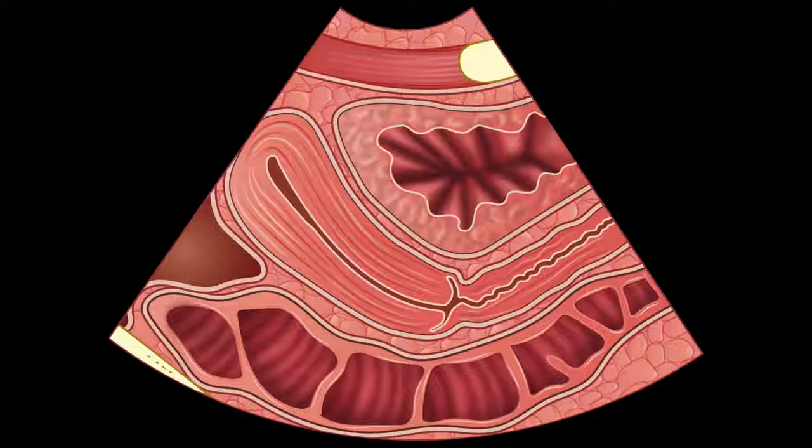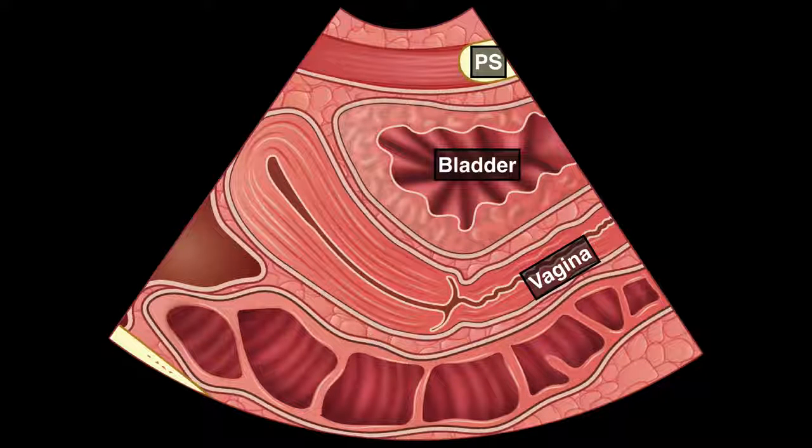The other reason is that if the bladder is decompressed, you may have some difficulty finding all of your landmarks. Rather than trying to differentiate bowel gas and decompressed bladder, starting the sagittal view allows you to identify the pubic symphysis as a bony landmark. After the pubic symphysis, we're going to identify some landmark organs. If it is a female patient, we're going to identify the vaginal stripe, then the bladder, uterus, and we're looking for fluid in the anterior cul-de-sac and the posterior cul-de-sac.